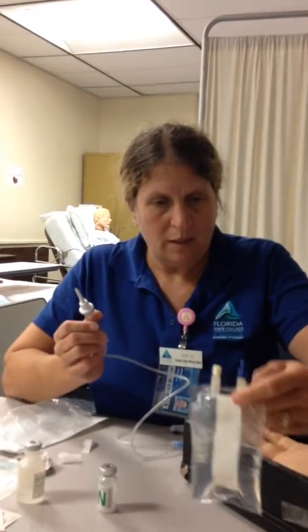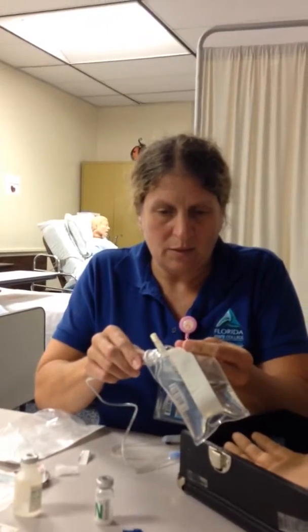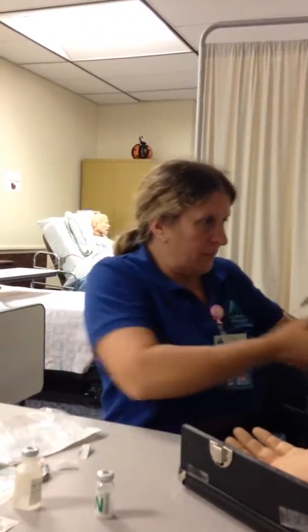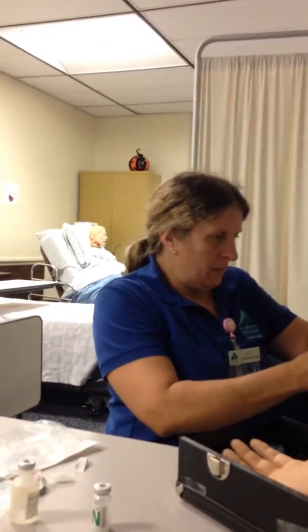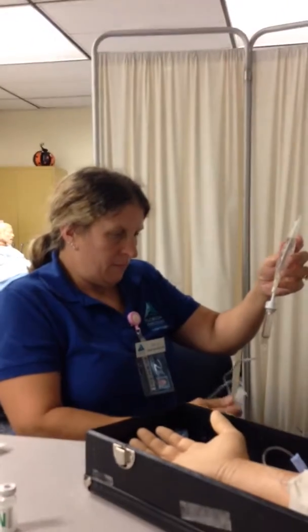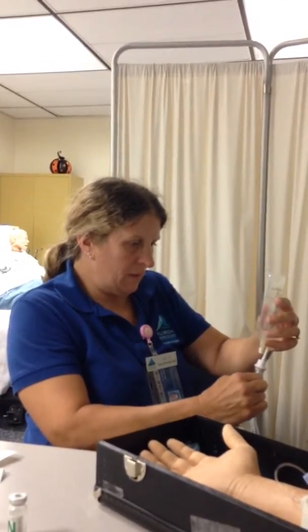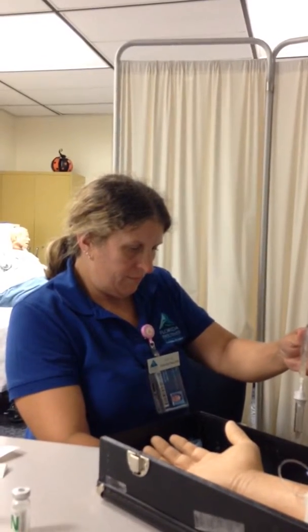I'm going to remove the lid off this and hang that there. At this point I am going to double check the IV site: no pain, no swelling, no redness. Everything is good to go. I am going to reestablish the correct flow so I can fill up the drip for the primary IV.